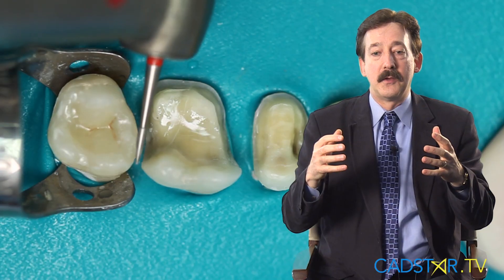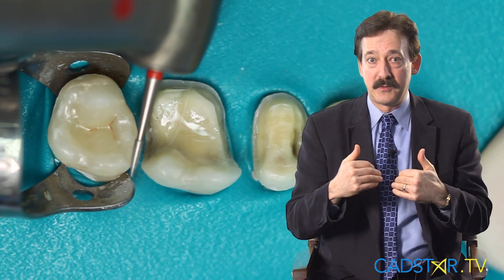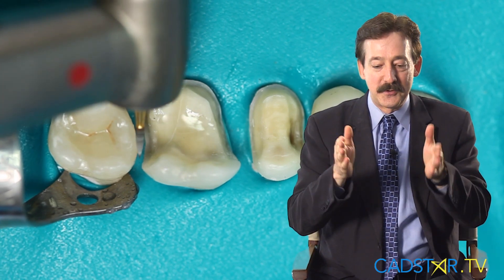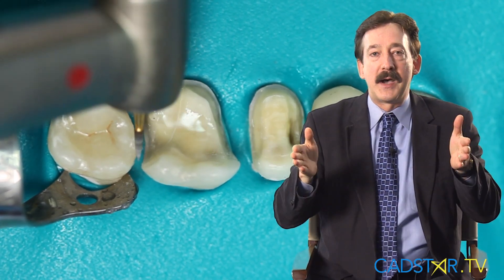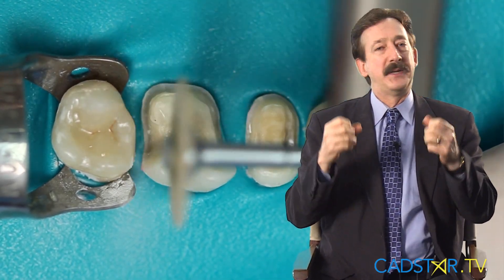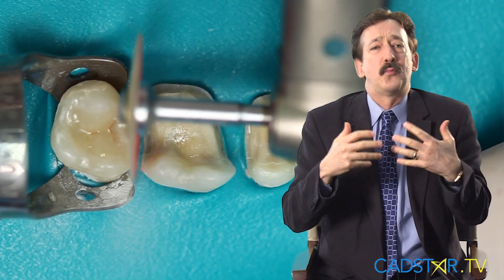The draw of your prep — we call it the optical draw — needs to have the same draw to the proximal contacts on either side of that prep. If you have a tooth on the mesial and a tooth on the distal, I want those contacts to draw with my prep from an optical and physical standpoint. That's why in my clinical theater I often modify the proximal contacts next door to that prep so I can optimize my clinical setup.